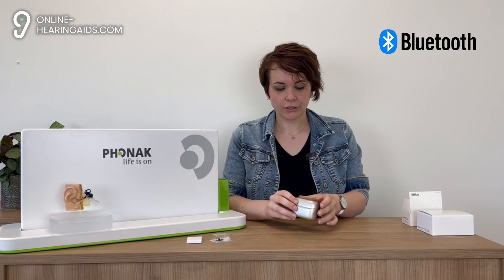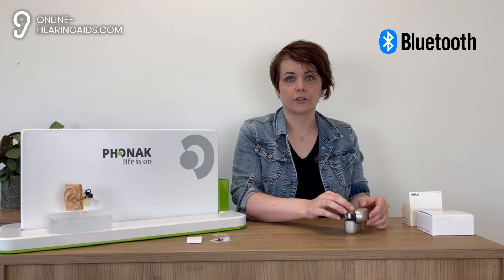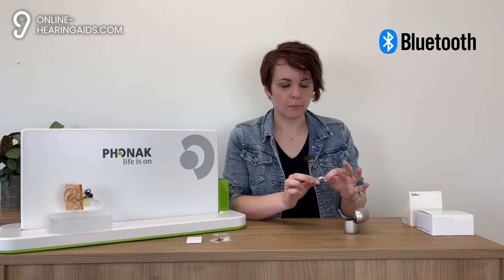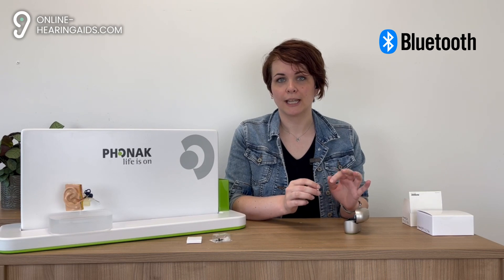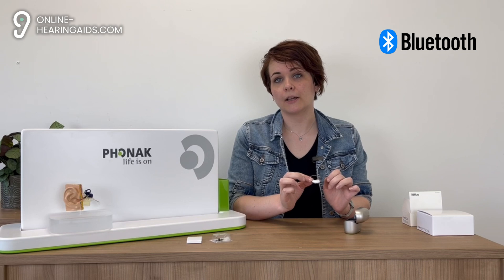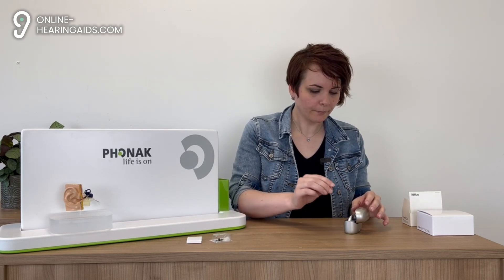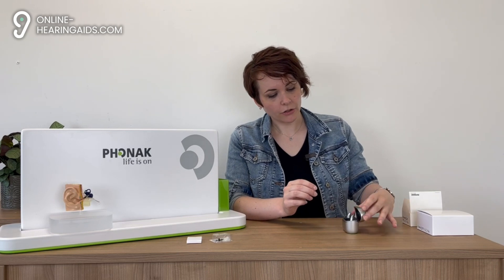In addition to the universal Bluetooth connectivity, these devices also have Auracast Bluetooth, which will take over the telecoil in public places in the near future. It also features low energy Bluetooth which saves battery life when you're streaming via another Bluetooth device. The devices are also compatible with the Phonak CROSS Infineo R for those who are looking for a solution for single sided deafness.